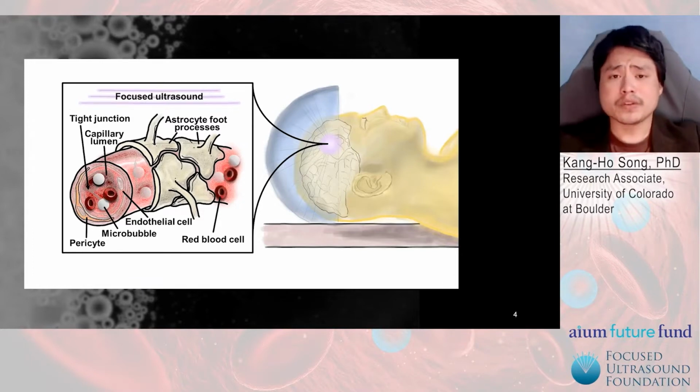In the case of tumor therapy, you could imagine that this technique could be used to enhance the permeability of tumors and enhance drug delivery, potentially allowing us to reduce the dose of chemotherapeutic necessary. And in the case of something like lithotripsy, microbubbles might be used to achieve a higher level of mechanical force on the kidney stones and improve the breaking of the kidney stones.